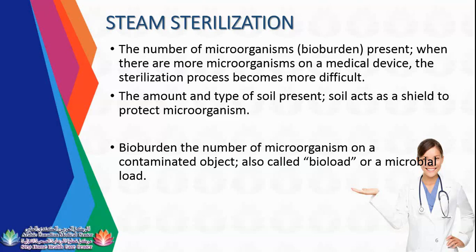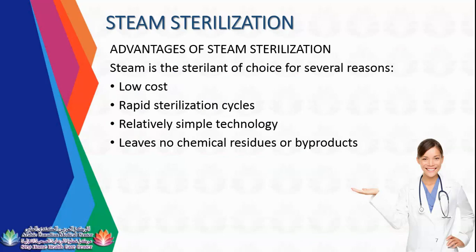Advantages of steam sterilization. Steam is a sterilant of choice for several reasons: low cost, rapid sterilization cycles, relatively simple technology, and it leaves no chemical residue or byproducts. Your ethylene oxide has, so you will discuss it more in the fifth week. Relatively simple technology: you will just place the pouches, close it, and then start.